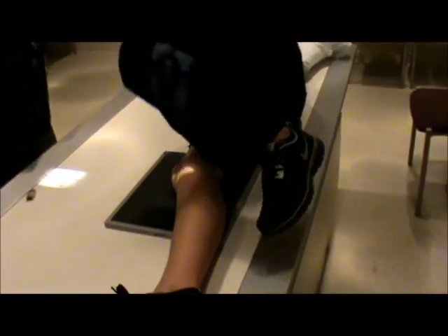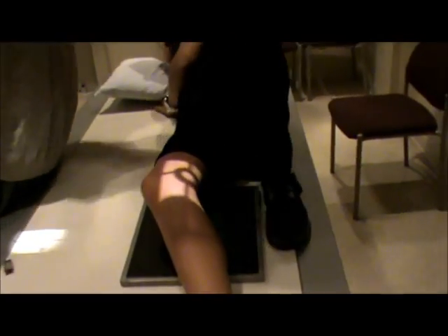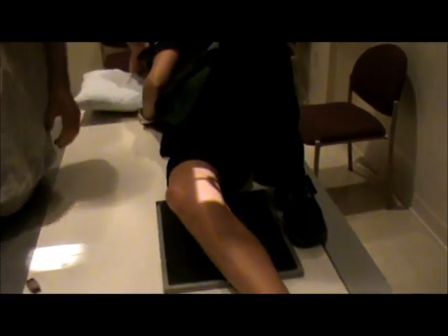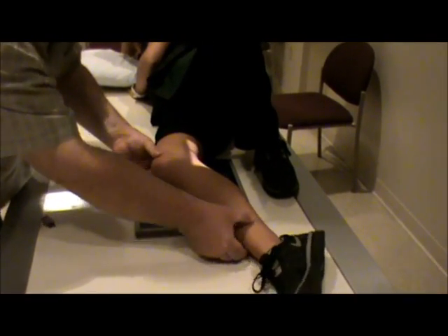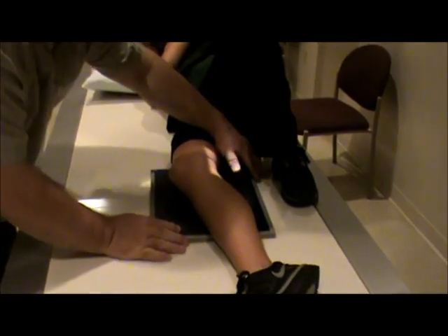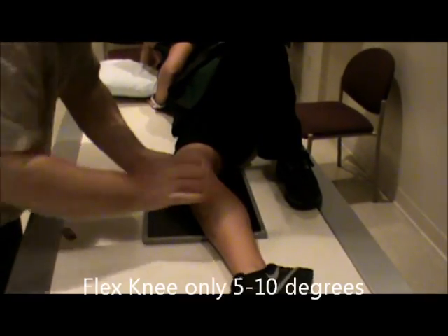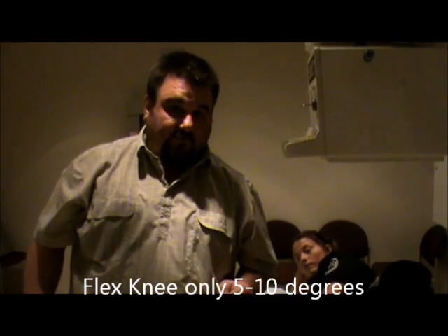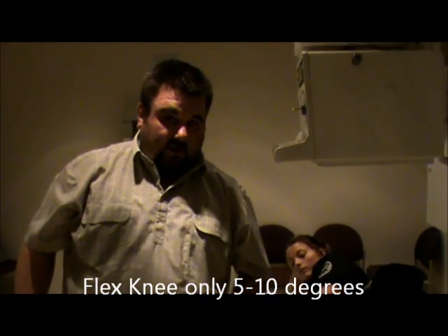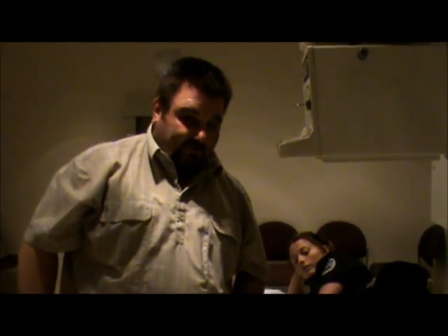We're going to have the patient roll onto the affected side and place the shield back over the patient. You do want to have the patient only flex the knee 5 to 10 degrees, because if there is a fracture of the patella, this can cause it to fragment. So we only have a slight flexion of 5 to 10 degrees.